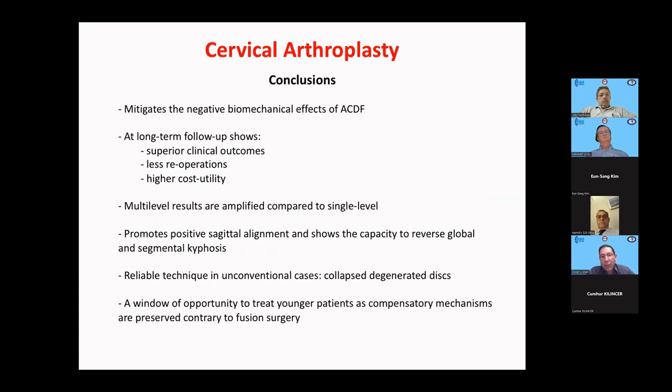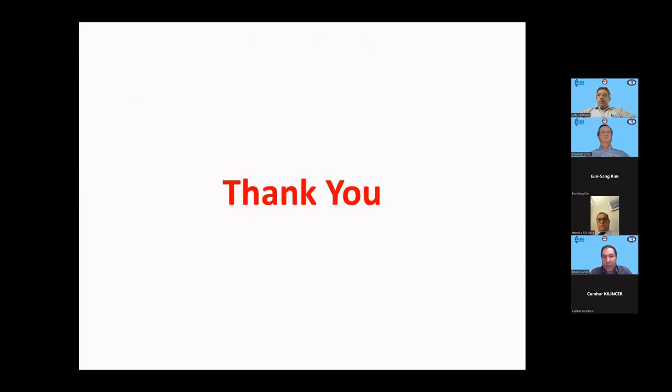At long term, it shows superior clinical outcomes, less reoperation, higher cost utility. If you do multi-level, these results are amplified compared to single levels. It can promote positive sagittal balance alignment, and there's the capacity to reverse global and segmental kyphosis. In my hands, at least, it's a reliable technique for unconventional cases, like the DISH case I showed you, the collapsed degenerated discs. And as I pointed out, it's a window of opportunity to treat younger patients as compensatory mechanisms are preserved, contrary to fusion surgery. Thank you.